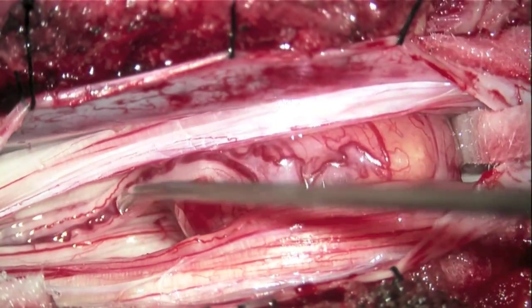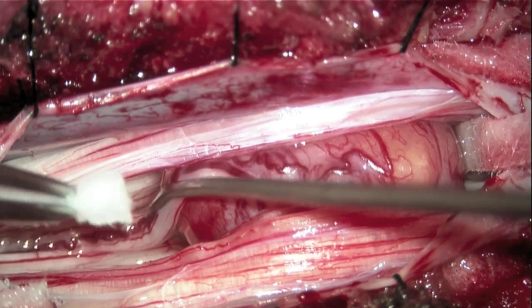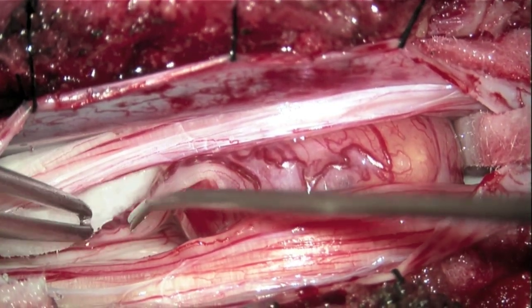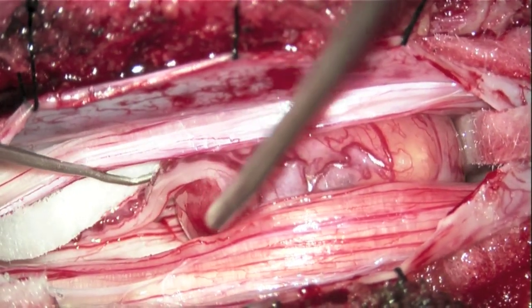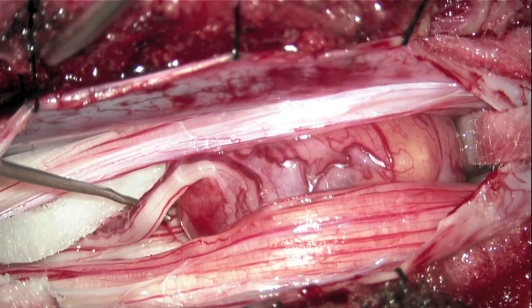The afferent limb of the nerve of origin of the tumor can be clearly seen. It is usually characterized by venous engorgement and swelling. The afferent limb of the tumor nerve of origin, in this case the right L4 dorsal root, is carefully dissected and mobilized.